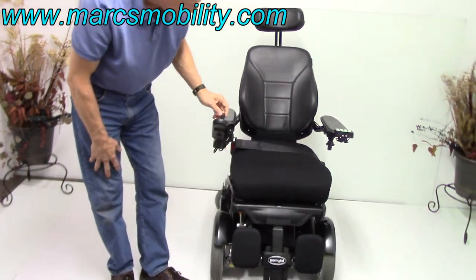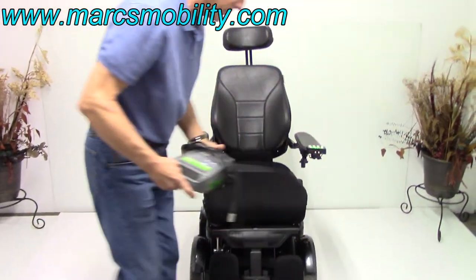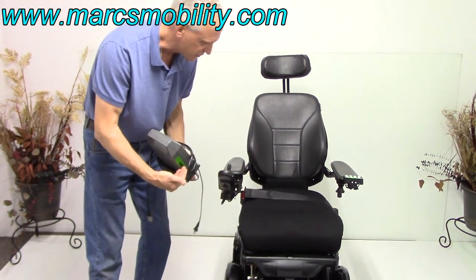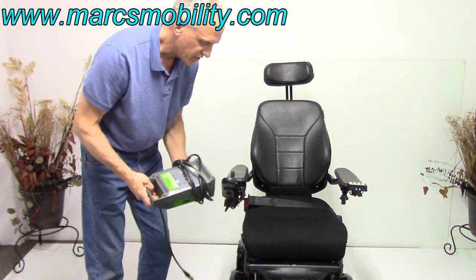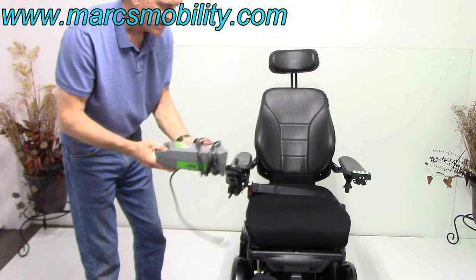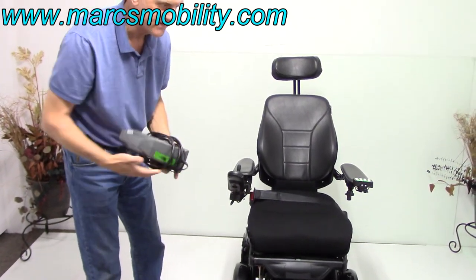When you charge this chair, like all Permobil, take your charger and plug it right here. As soon as the light turns green on your charger, you're fully charged. You don't have to worry about overcharging because as soon as it's full it'll stop charging. You can leave it on all night — the light will be green, and if it loses a little power it'll charge a bit more and stop again.